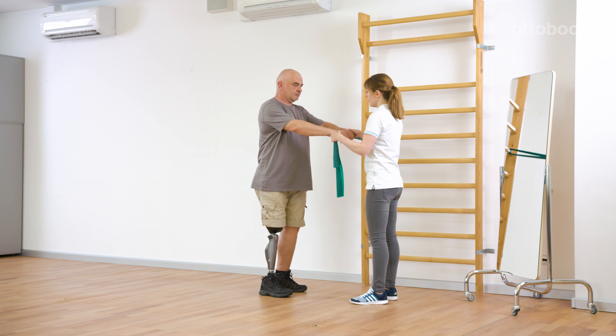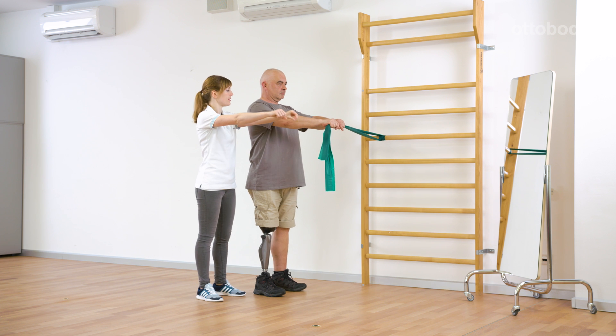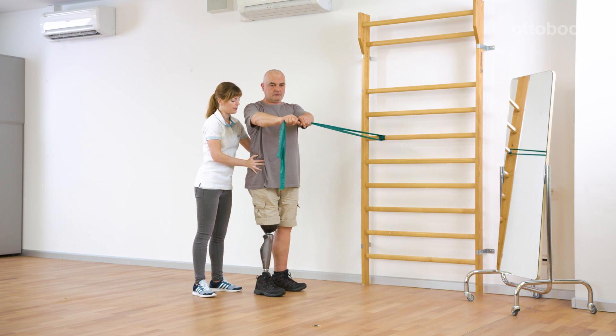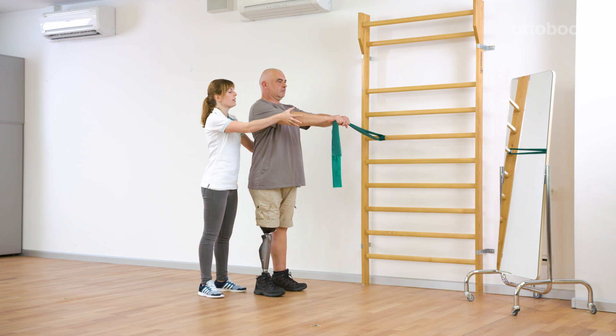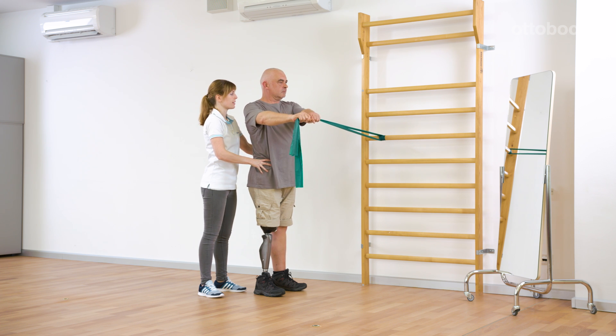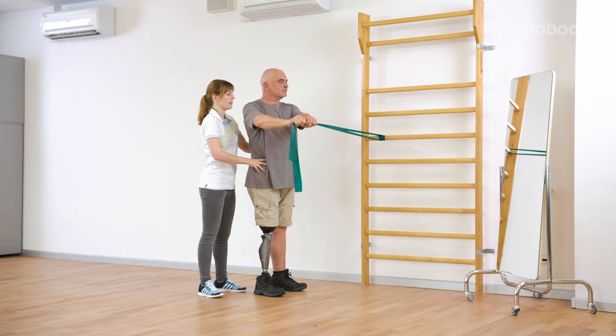The following exercise works to strengthen the core muscles and to increase stability while standing. Both shoulders stay relaxed while the strap is pulled sideways using both hands. During this movement, the hip stays directly forward instead of rotating. Using a mirror, Gerhard is able to independently check the position of his shoulders and the movement of his hips.